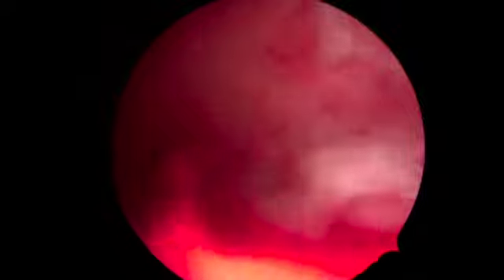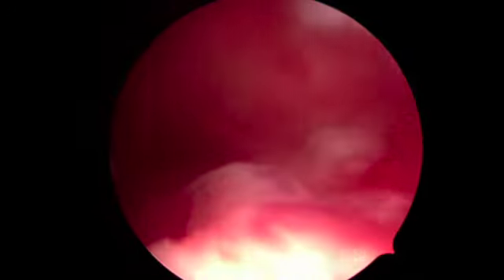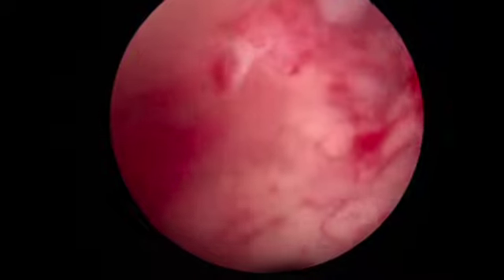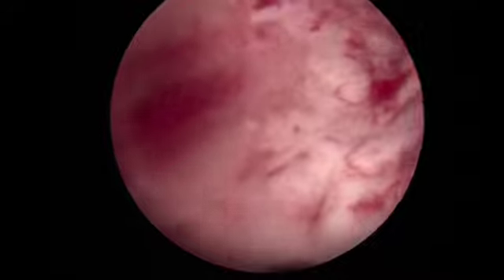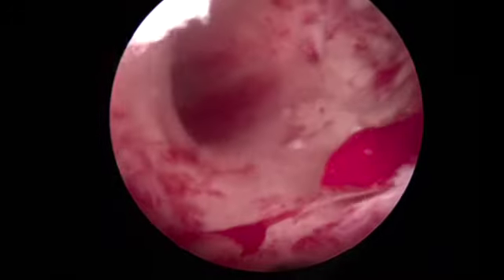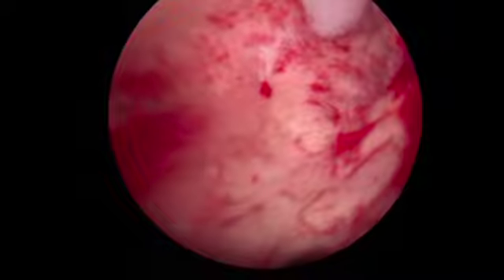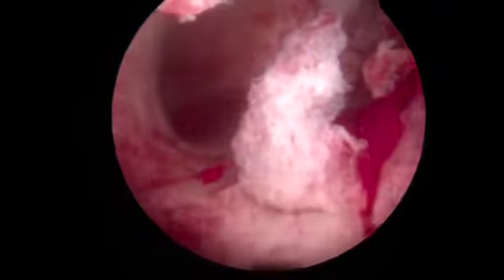Finally, we are able to get the entire polypoidal lesion out, and this is very important when you are suspecting it not to be benign. Now we go towards the posterior wall, and as you can see, these are sessile growths scattered, definitely not having the appearance of a benign lesion.